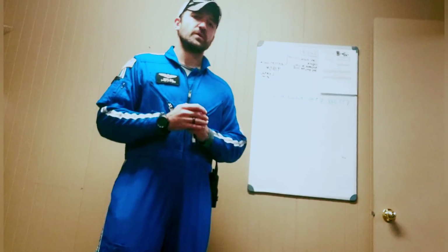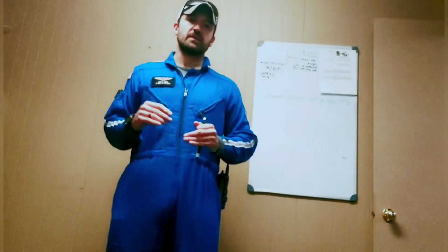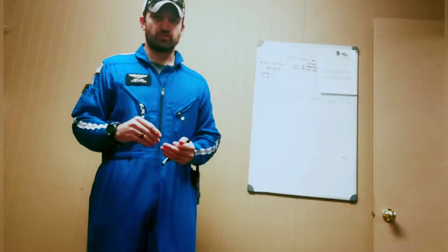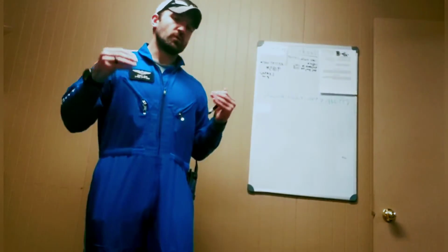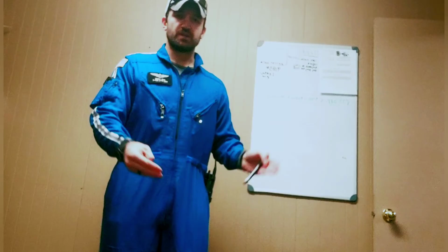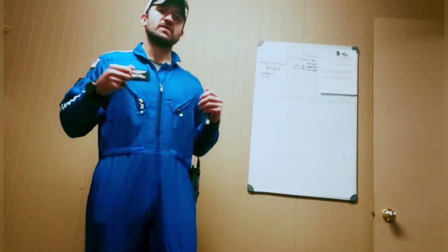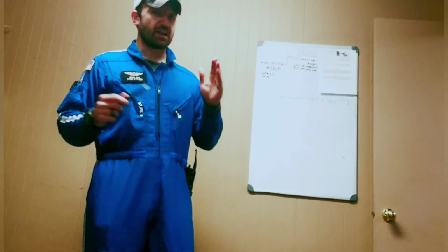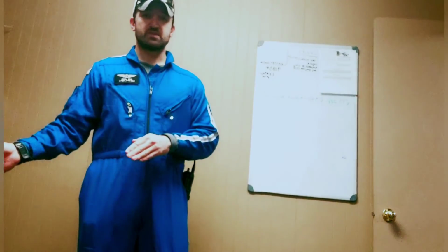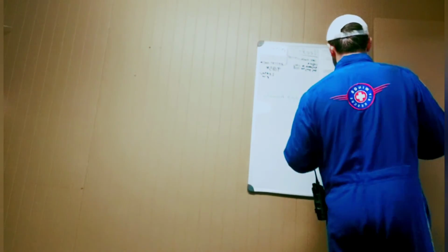Okay guys, so what we're going to do here is a quick demonstration on how to calculate the initial ventilator settings for a patient, okay? So we've walked into a room, perhaps they're already intubated, maybe we intubated the patient and they're receiving bag valve ventilation. First thing we need to do is determine the patient's height, okay? So we've done that, the patient we've estimated to be about 6 foot tall. I'll move to this side so you guys can see a little better.